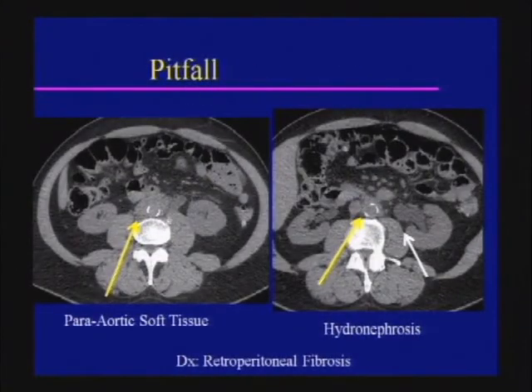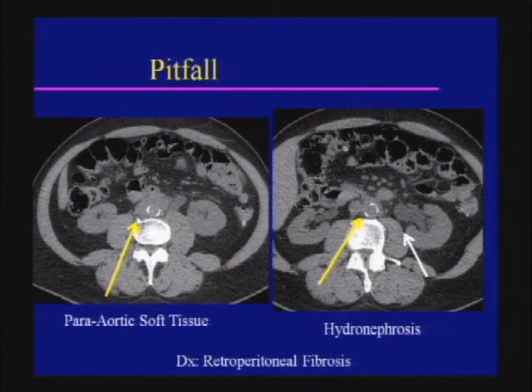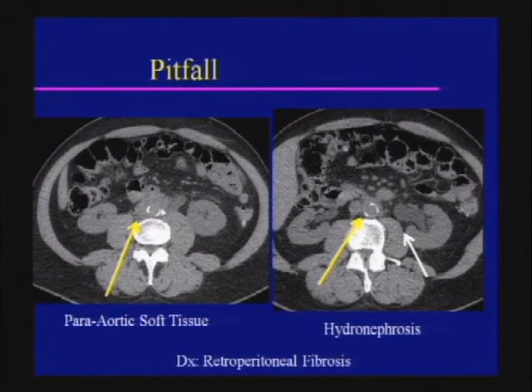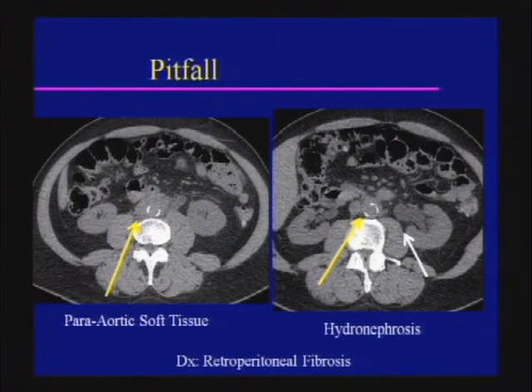A pitfall of AAA imaging: abnormal para-aortic tissue without an abdominal aortic aneurysm, with para-aortic soft tissue and hydronephrosis, represents retroperitoneal fibrosis. Lymphoma would also be in the differential for this appearance.